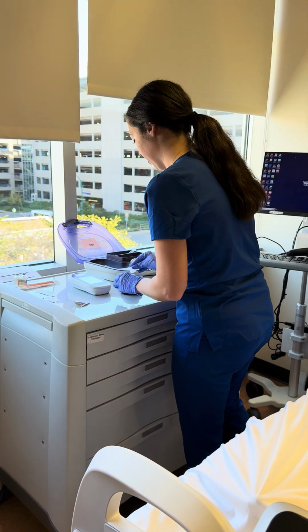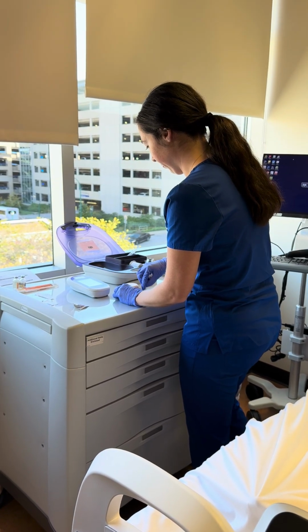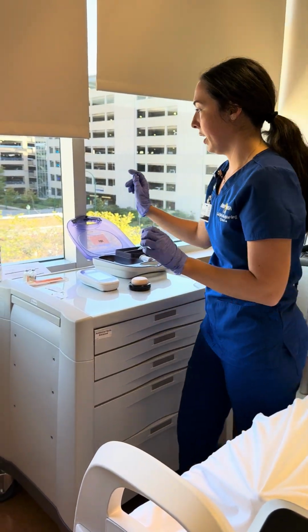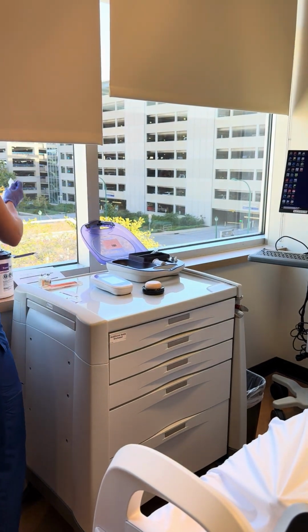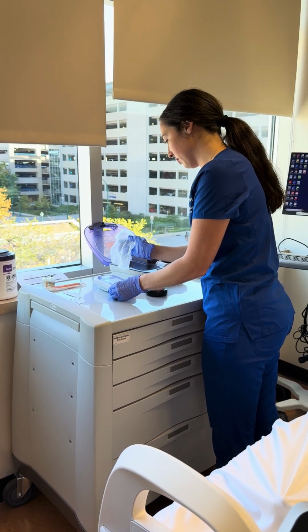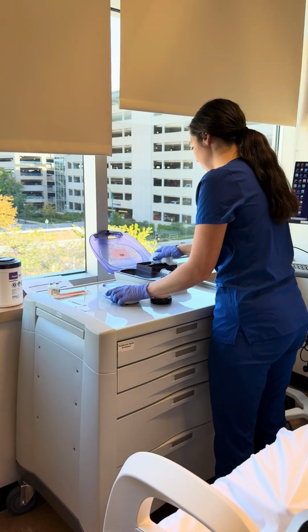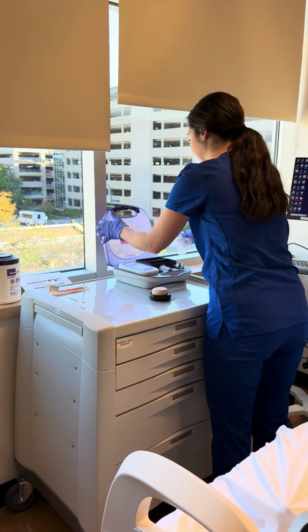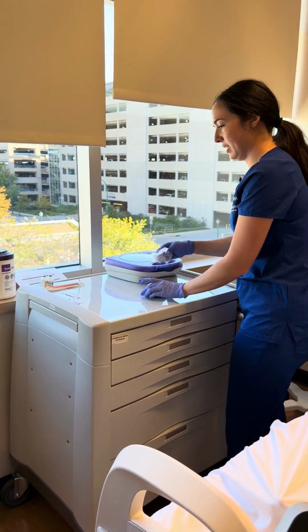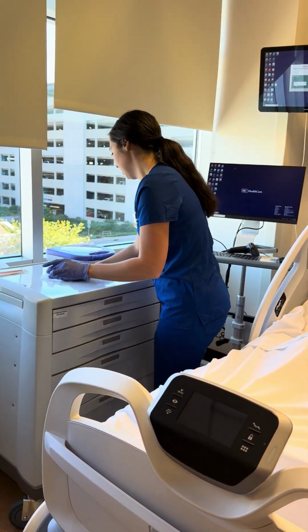Go ahead and wipe off the area clean. Okay. Alright, using my gloves, I'm going to go ahead and wipe down the machine and power it off. Okay. Wipe it down. Place it back in the bin. Wipe everything down. And put it off to the side. So we are now done with that area there. Wipe down this desk.